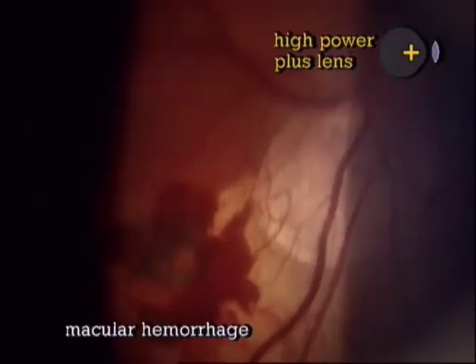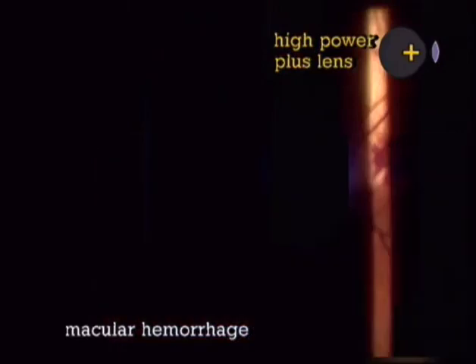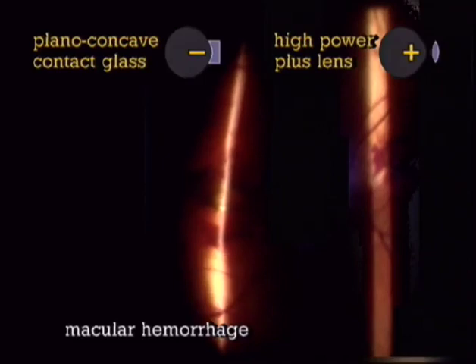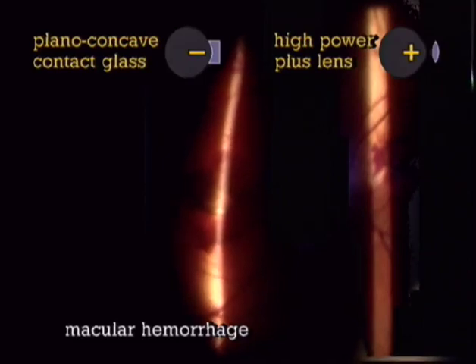When interpreting pathology, such as the slightly prominent macular hemorrhage seen here, the flattening suppresses the prominence because any three-dimensional changes become less recognizable. But with the plano-concave contact glass with the narrow slit, even the tiny elevation can be recognized by the uneven curvature. So, three-dimensional phenomena are better imaged with a plano-concave contact glass.